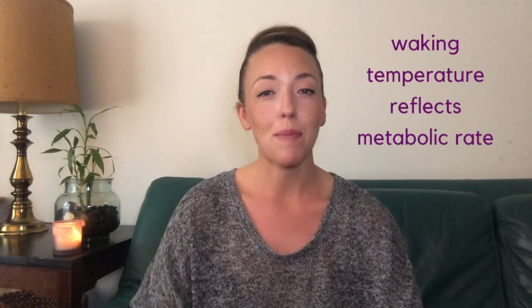Here's why. Like we talked about in the first video, if you remember, the whole reason we take our temperature is because it is a reflection of our metabolic rate, which is influenced by our hormones. So as soon as you start doing things, you raise that metabolic rate, and you're not going to get an accurate reading, because at that point it's going to be reflecting you moving around, you getting up, you doing whatever else you're doing. It's not going to show you that very vital information, which is that base metabolic rate that you get to when you're sleeping. So that's why it's so important that you take your temperature first thing before you do anything else. Okay, so that's number 1.